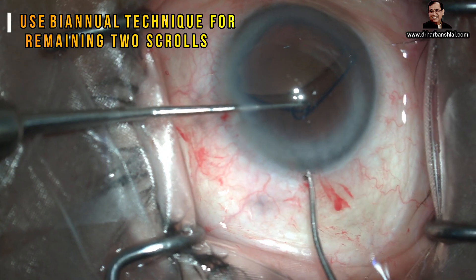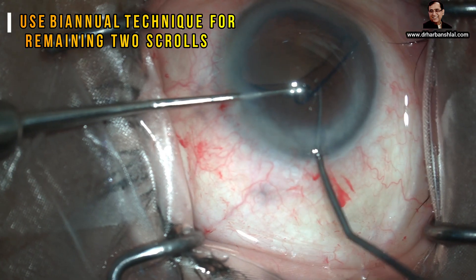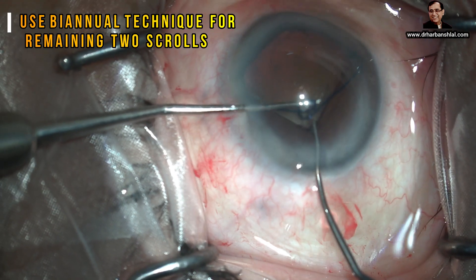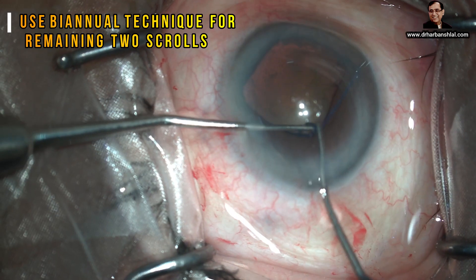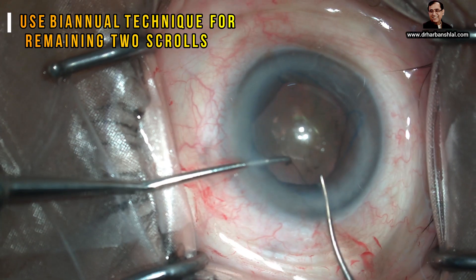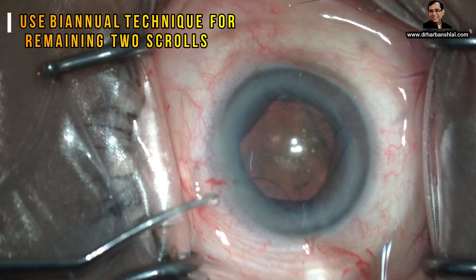So we use the bimanual technique. We pull the iris border towards the incision with one instrument, and another instrument hooks it and releases it. This bimanual technique is very useful for the last engagement.